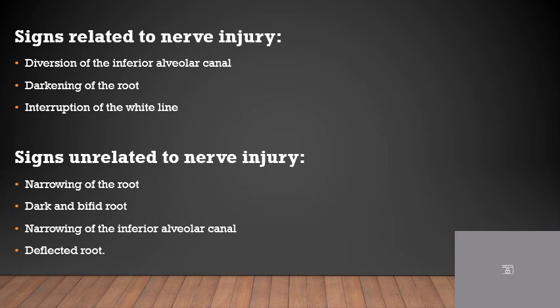So while removing the third molar, you may encounter inadvertent bleeding due to disruption of the continuity of your inferior alveolar neurovascular bundle, which has the inferior alveolar artery along with the nerve. Thus, when you suspect that kind of radiographic finding, it's always better to go for procedures like coronectomy, or you should have precautionary methods which can stop the bleeding in case you injure the neurovascular bundle.